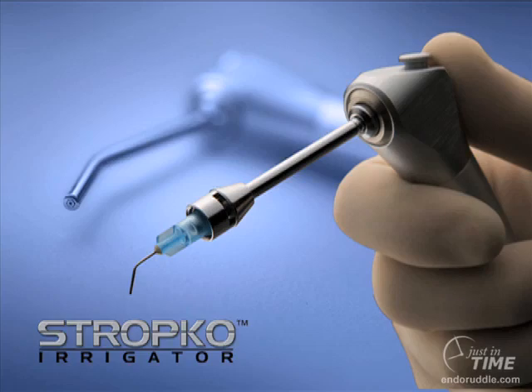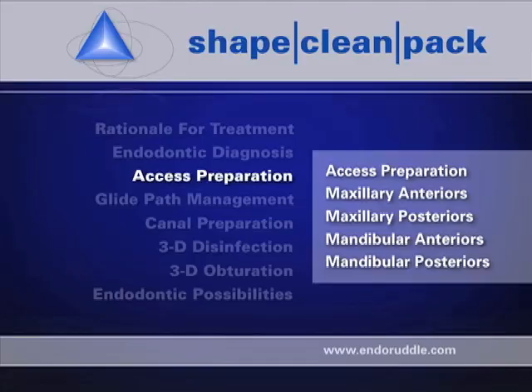Collimating air and water into the field of activity means less aerosol and better visibility. Okay, we've looked at several tools that can be utilized to cut and finish access cavities. Hopefully, the tools that you've seen in use will give you some ideas about how to more competently prepare your access cavities on a go-forward basis.